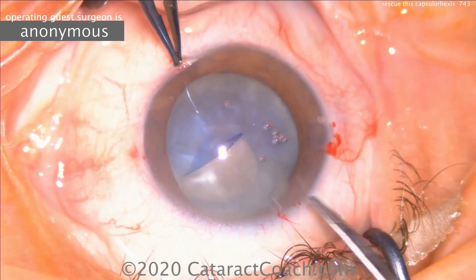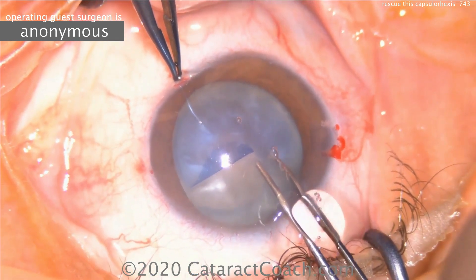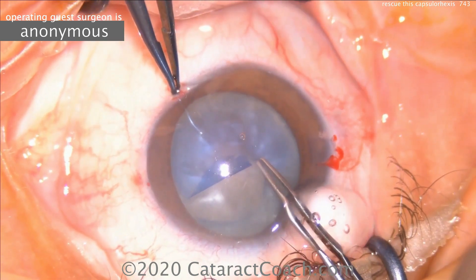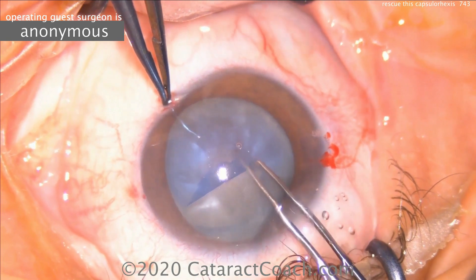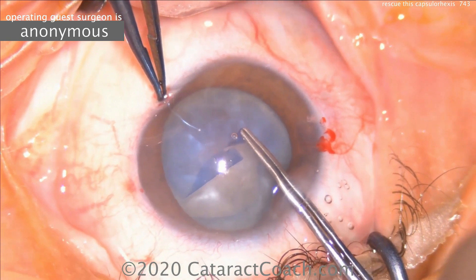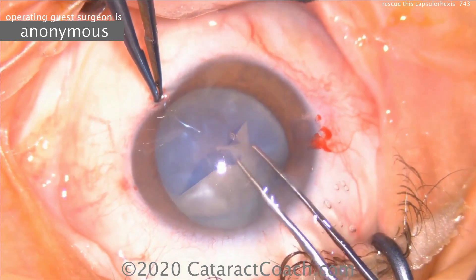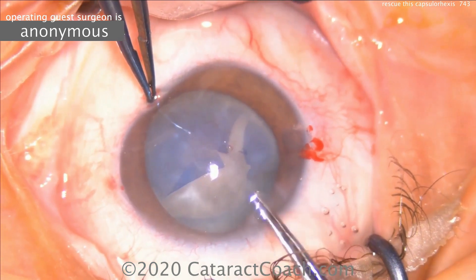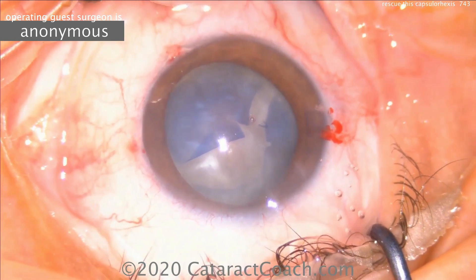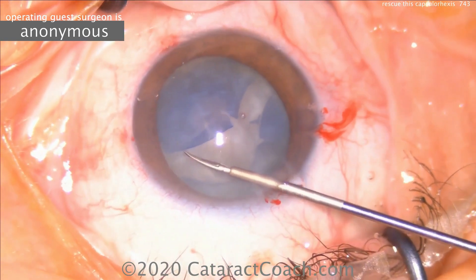The cortex in the capsular bag has been liquefied and is pressurized. Trying to go the other direction, but still we have a pressurized posterior capsule. There can be liquefied lens cortex under the nucleus, pushing the nucleus anterior. Trying to start the capsulorexis from the other side and pull around — it just radializes, because the nucleus is pushing up.